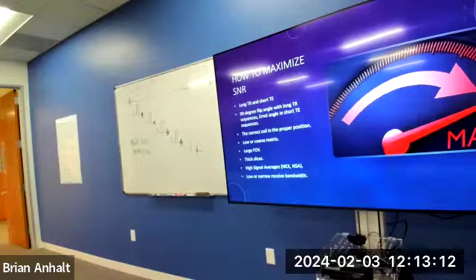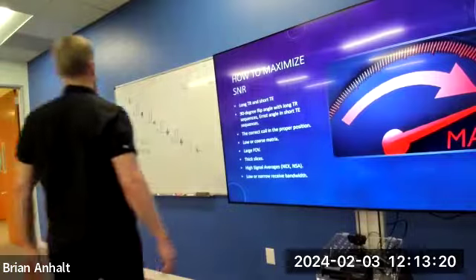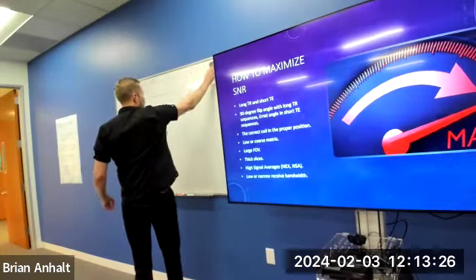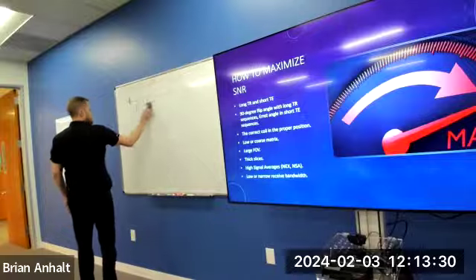But it's a trade-off, right? We're not always trying to get the best SNR. We're trying to trade it in for other things that we need as well. There will be some scan math about voxel size, pixel area, and voxel volume. What 3 parameters control our pixel area and our voxel volume?